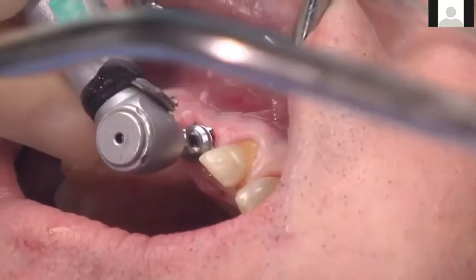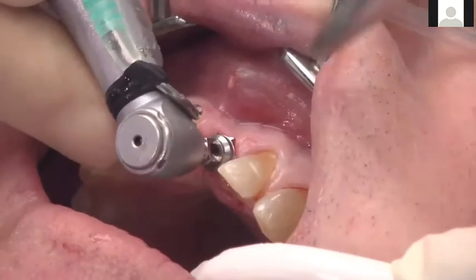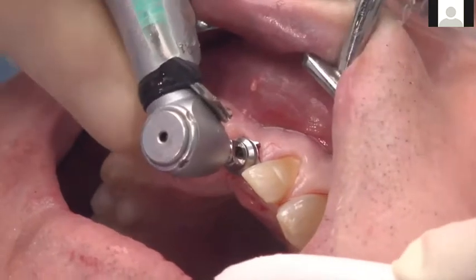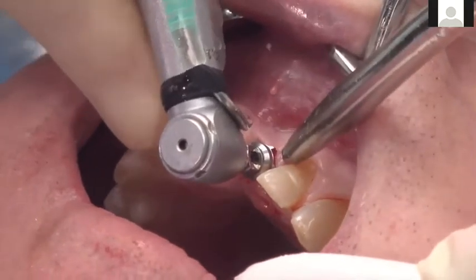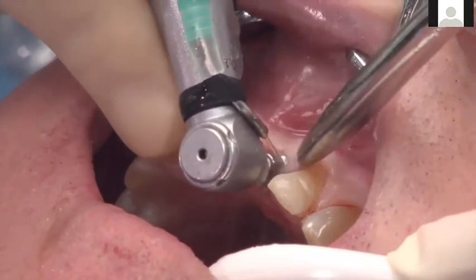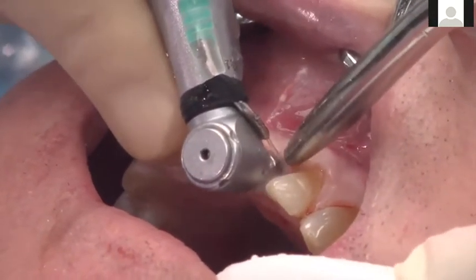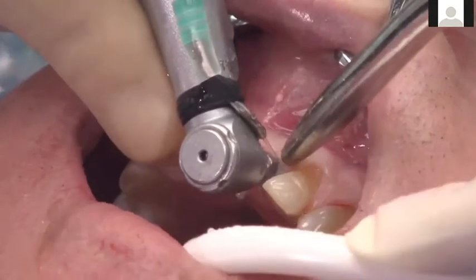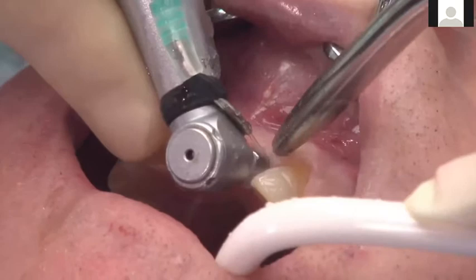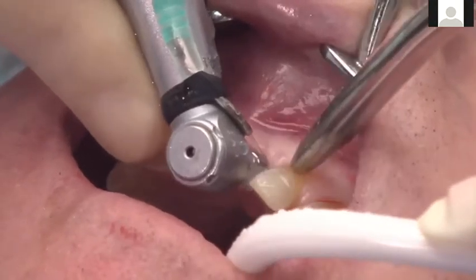So I check that to make sure that I'm not removing too much tissue by just going to the size 2 immediately. And you can see here, this is a very careful check. Once I verify that, now I can go ahead and basically do the profiling with the size 2. Size 3 is something that you don't do in the anteriors. That's only for posterior molars. And if this was a lateral, I would just stop at size 1. So you can see this is size 2, profiling the bone and the tissue here in a very guided fashion.